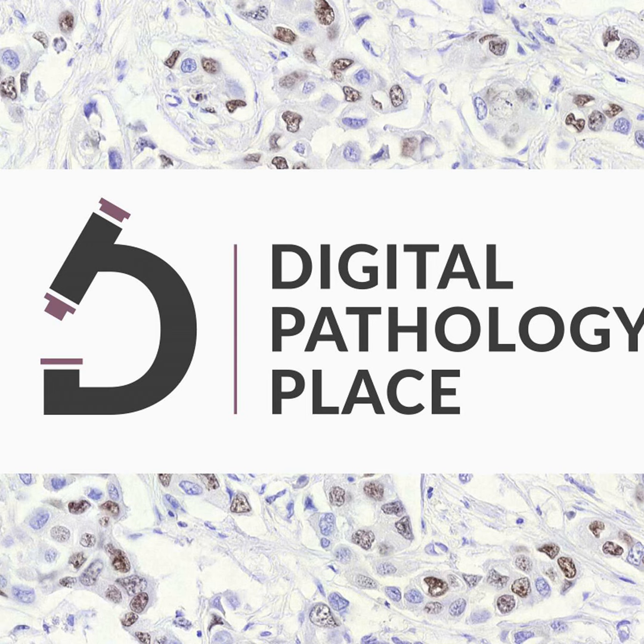3. WSI retention. For GLP-compliant studies, if digital slides are assessed in lieu of glass slides, the FDA mandates the preservation of digital slides post-use, mirroring the conventional practice of retaining glass slides. This requirement enables data traceability and facilitates information retrieval, both crucial for the review process.